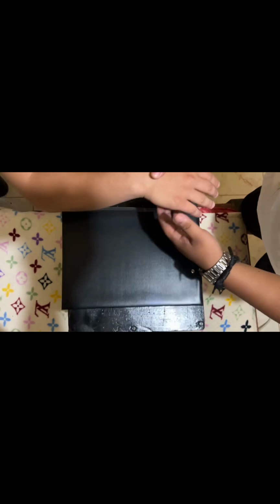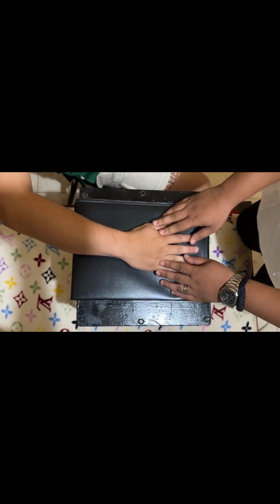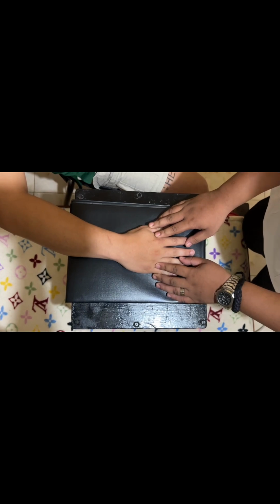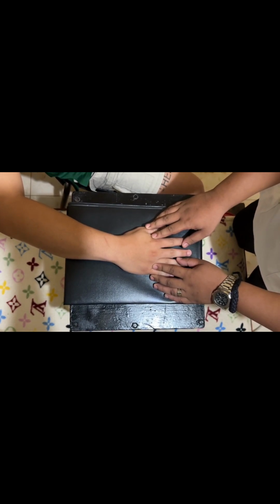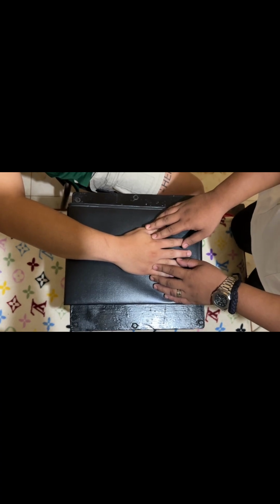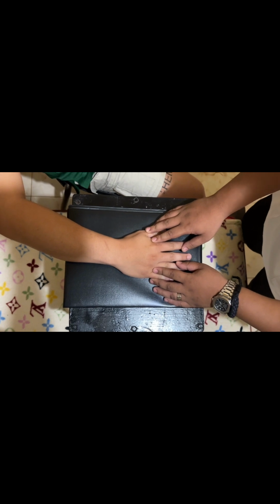So I'll be demonstrating the finger routine first. First, let the patient sit at the end of the table with forearm resting on the table. The clinical indication for this is first fractures and dislocations of the distal, middle, and proximal phalanges. Second is pathologic processes such as osteoarthritis and osteomyelitis.